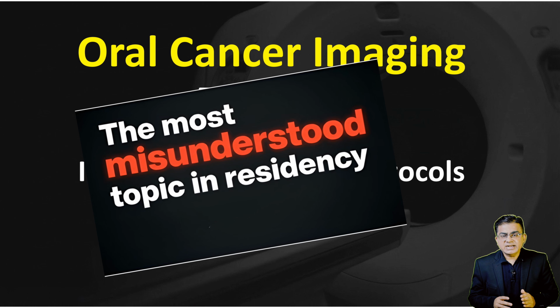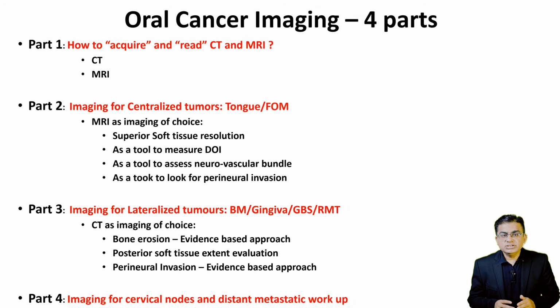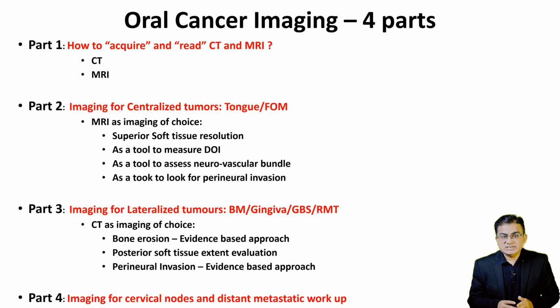Let me be clear right at the start. I am not a radiologist. I am not here to teach you how to dictate a standard descriptive radiology report. I am an oncologist and I am going to teach you how to use the scans to dictate the extent of tumor so that you can make critical decisions such as surgical resectability and defining radiation target volumes. Getting the image right is the foundation of everything we do in head and neck cancer.